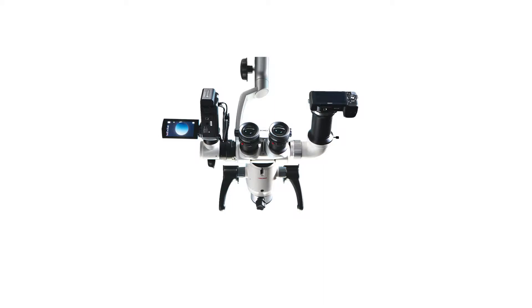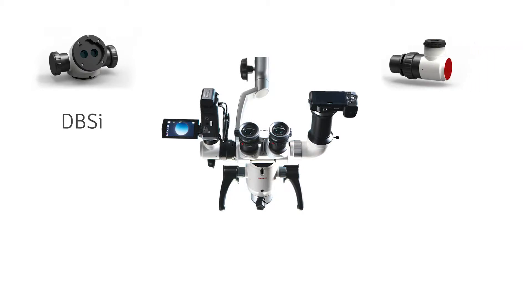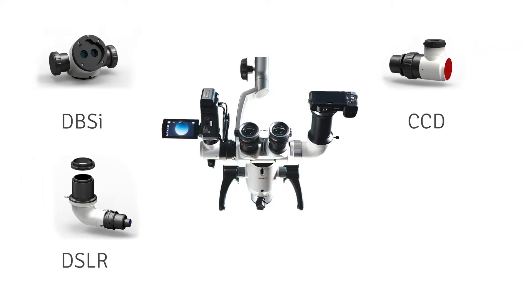The ProLine offers a series of video adapters and ergonomic accessories, including our incline double beam splitter, adapter for CCD cameras, DSLR adapters for Nikon, Canon, and Sony cameras, and our traditional flat double beam splitter.